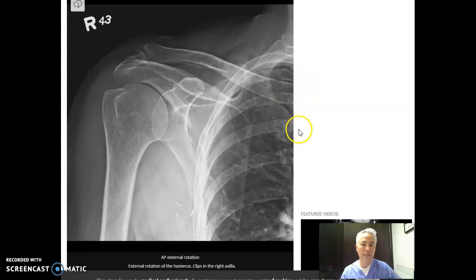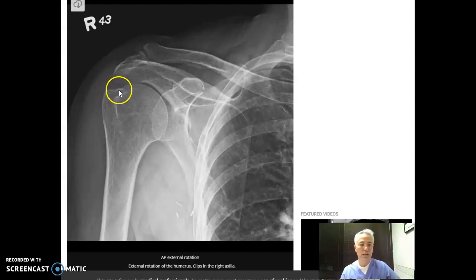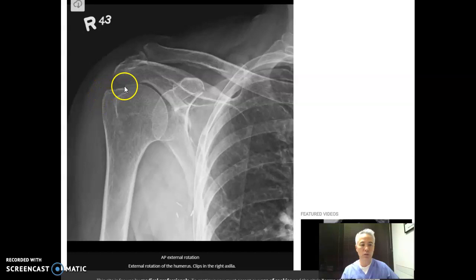We're showing this image for this portion right here — this is your greater tubercle. We cover this a little bit with the humerus, but the greater tubercle is what you need to see. This is what you get when you turn your hand palm out in a true anatomic position. What that does is it gets the greater tubercle in the proper area and also brings the lesser tubercle right through here. So this little density that you see here is your lesser tubercle.